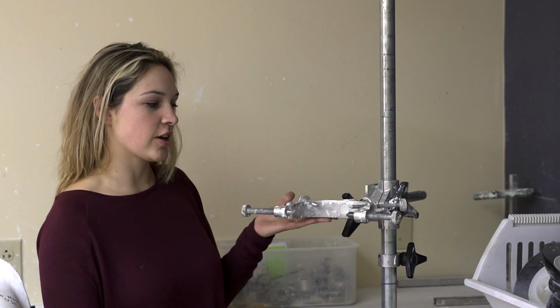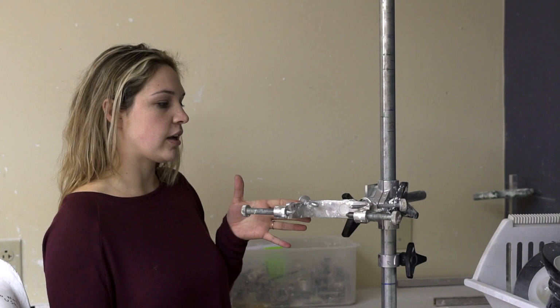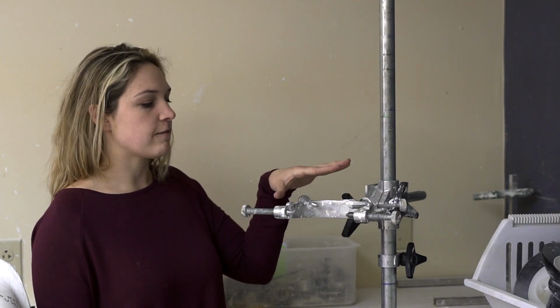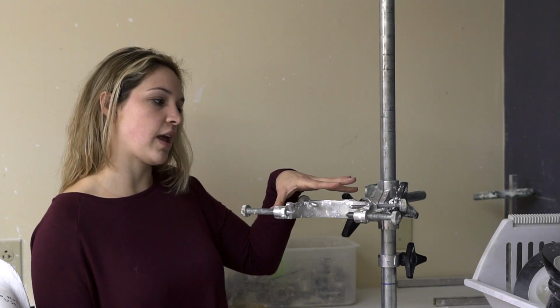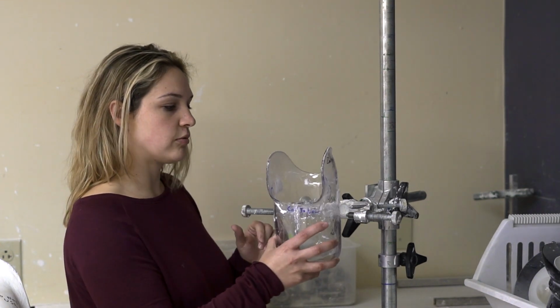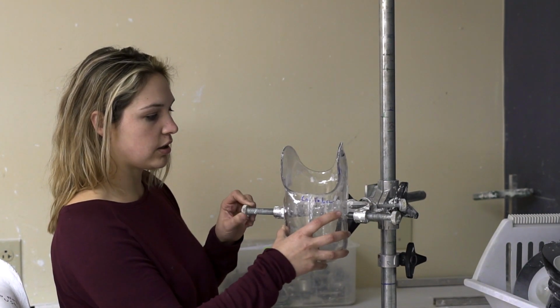First, we have the check socket crown, which will hold the check socket and allow us to put the check socket into knee flexion or extension and abduction or adduction. So do it like this, and we'll put the check socket in, and this will hold it.